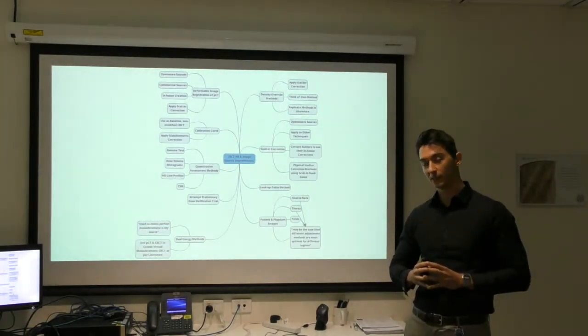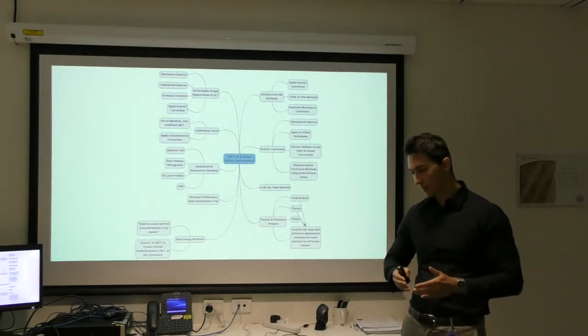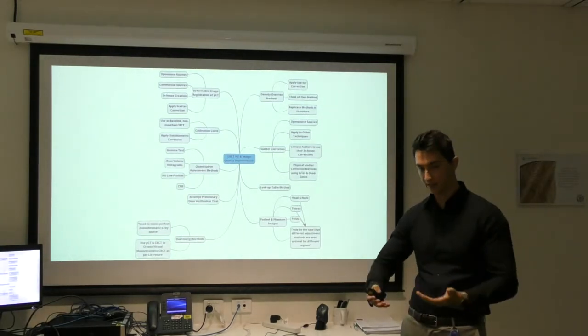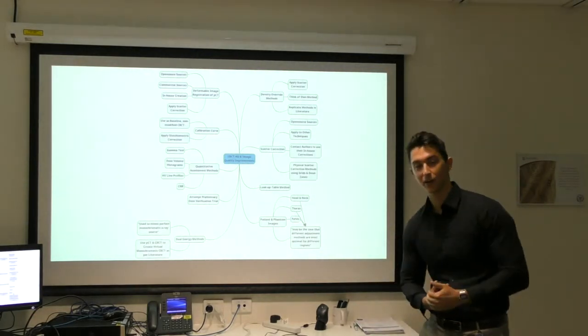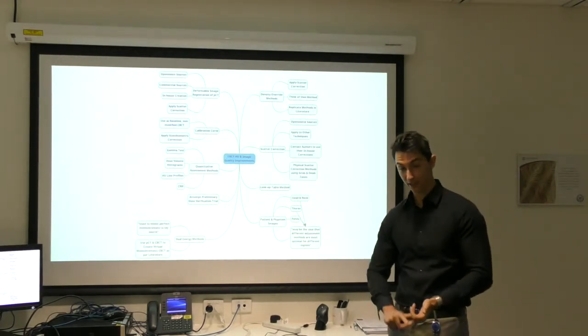I won't say it's as good as the filtered back projection, which used all of the data points, but in terms of IGRT applications, as in just patient positioning, it was up there. It could easily be used for that. And so that effectively means a 75% reduction of the dose. Yep. So iterative actually increases image quality and has the potential to decrease the dose.